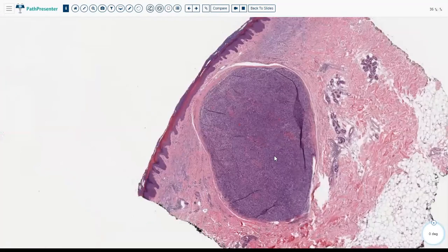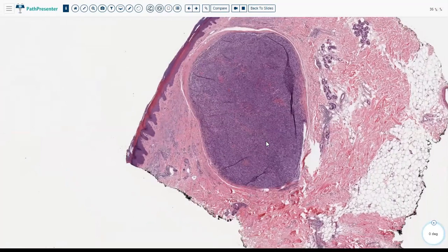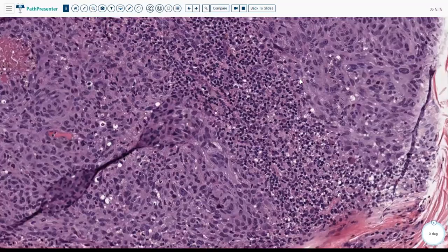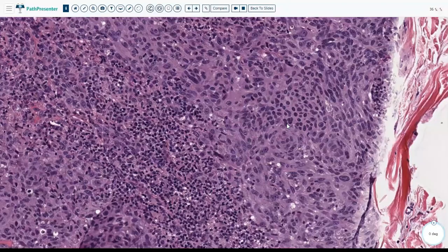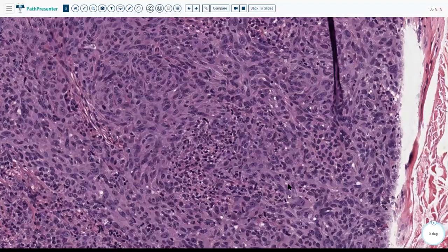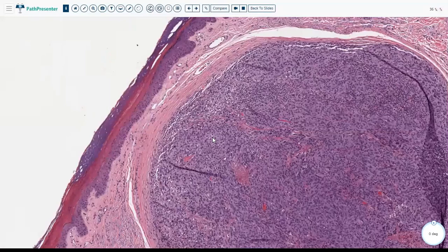This is a metastatic melanoma. Very quickly, I will not go through it in much detail. If you can see here, large nodules, lots of mitotic figures, lots of pleomorphism. You see large abnormal cells throughout, and usually we like to describe them as cannonballs. No epidermal component, if you notice, no epidermal component.